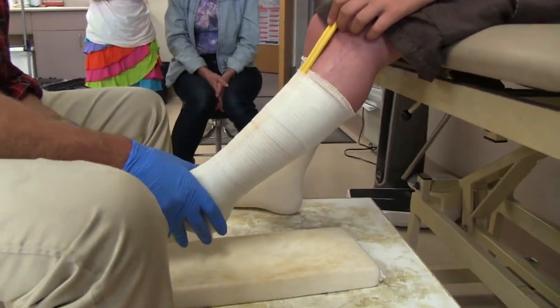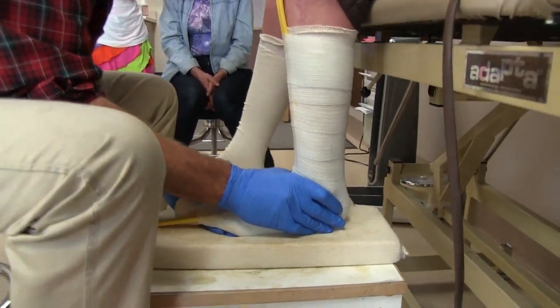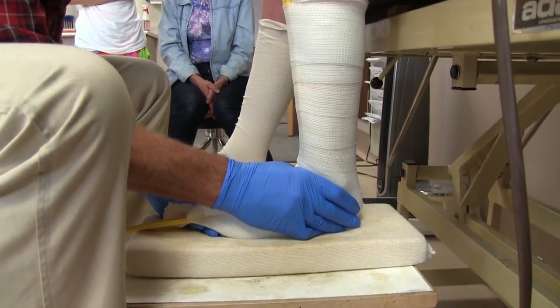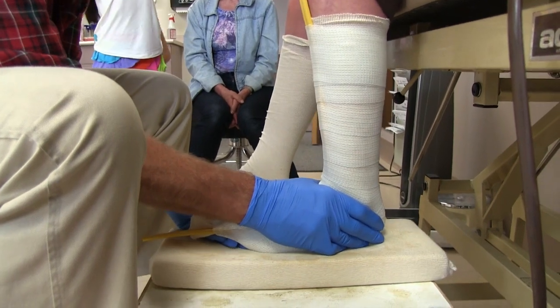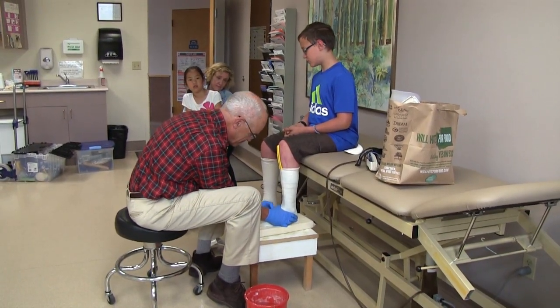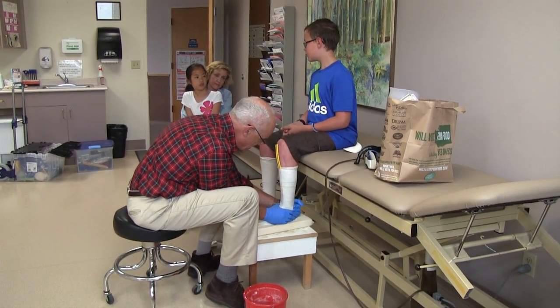Two, the best fitting brace is made from a patient held in their best position of function. That may be a vertical heel, level forefoot, and slightly dorsiflexed ankle, or an accommodation to something as close as possible to this balanced position. Most patients in need of DAFOs will have to be realigned and held in that position for scanning. A cast is currently the best way to accomplish this goal.